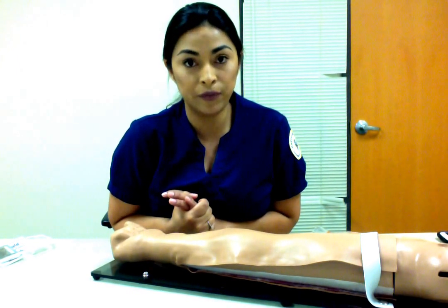Again, it's a good idea to wait at least 30 minutes, or to make sure the patient is on their FiO2 or their oxygen device for at least 30 minutes to get an accurate blood gas result. And that's it.